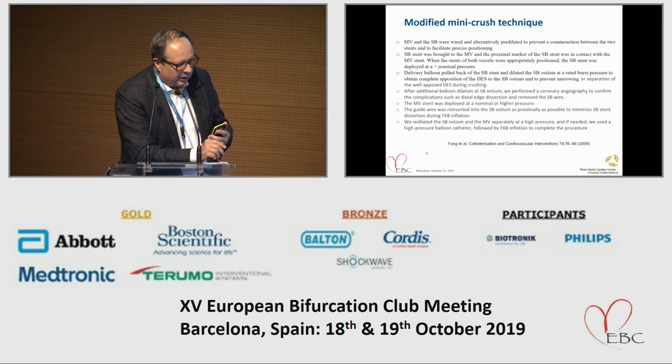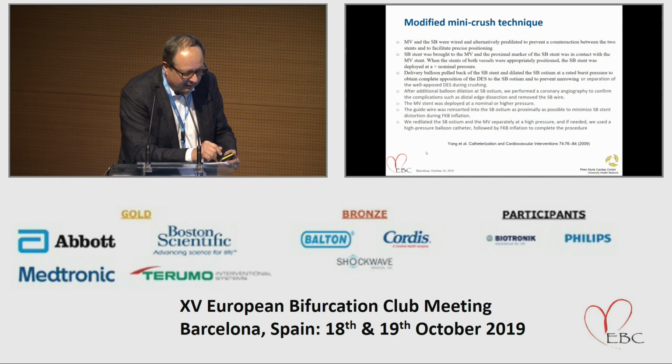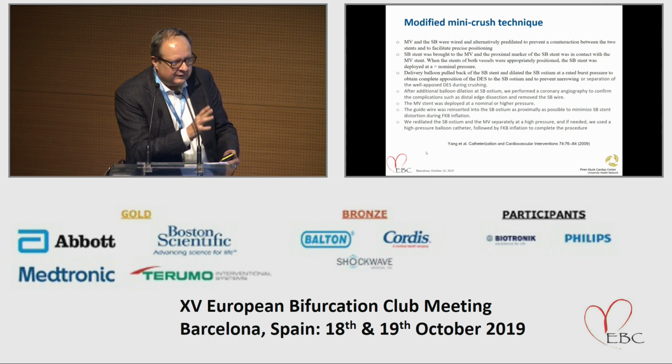This brings me back to the modified mini crush, because it actually has very good results, and there haven't been large trials doing this. I'm not sure that even when Xiaoling Chen compared the DK crush versus a mini crush, this is the technique they used. It was described by Yang 10 years ago, in a very detailed description.